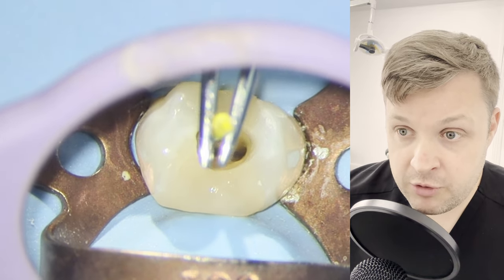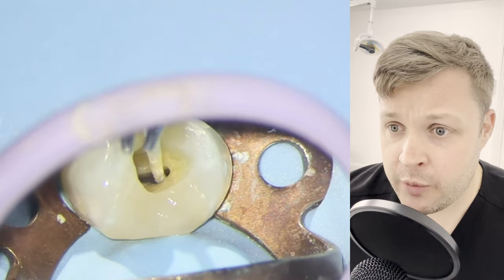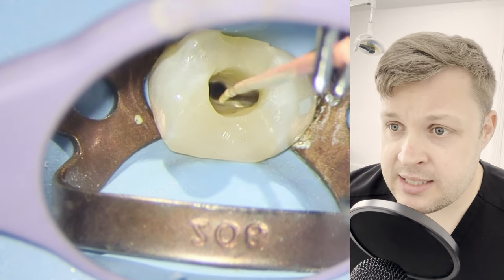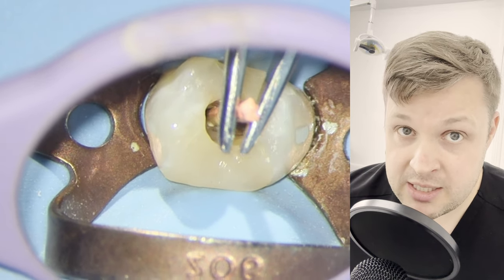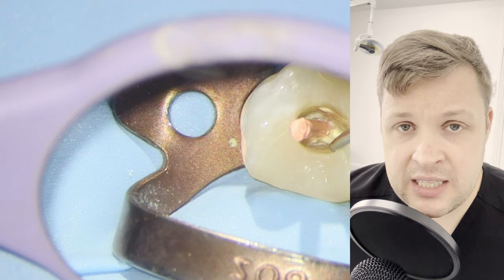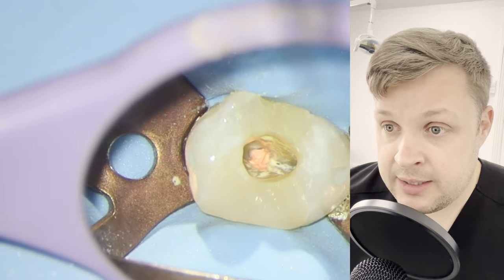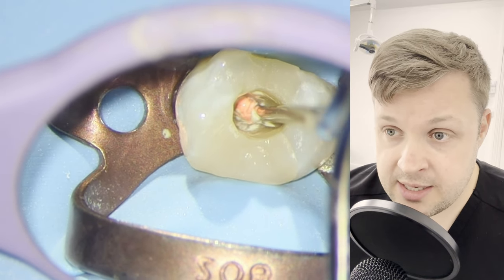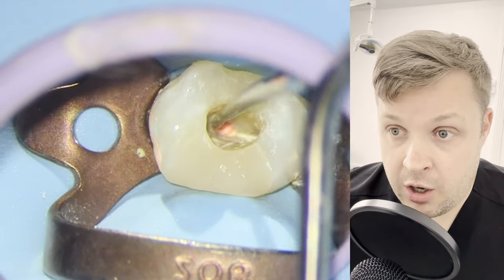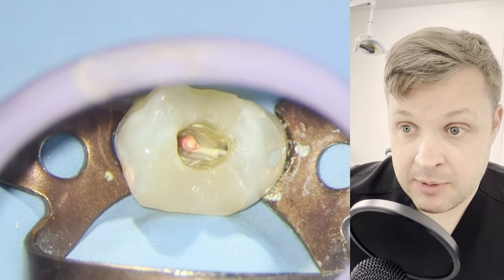So the final thing we do before we obturate: we irrigate the tooth and ultrasonically activate the irrigation, then use paper points to dry the tooth. The sealer we're going to use is AH+. I've been using AH Plus a lot recently, although I have gone back to using a bioceramic sealer. In this case I probably thought I might use a bit of heat, and that's the reason I've used AH Plus — because you can't use most bioceramic sealers with heat. I'm using a heated plugger just to cut off the excess, and then I'm going to push very firmly with the heated plugger onto the remaining GP and compact it right down, wait 10 seconds, and pull away.